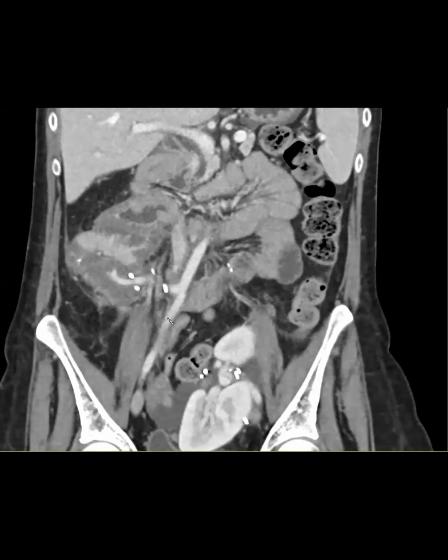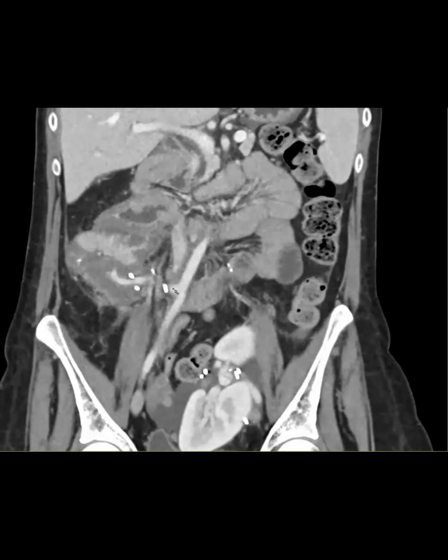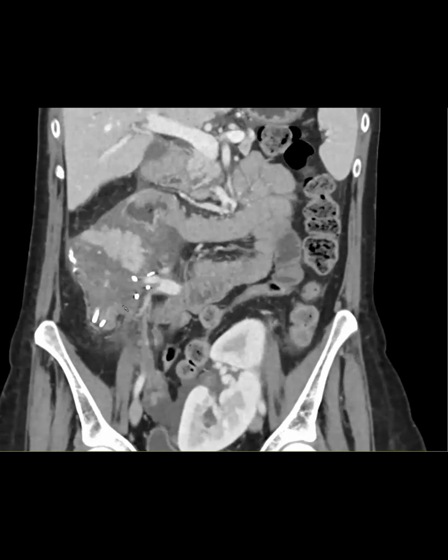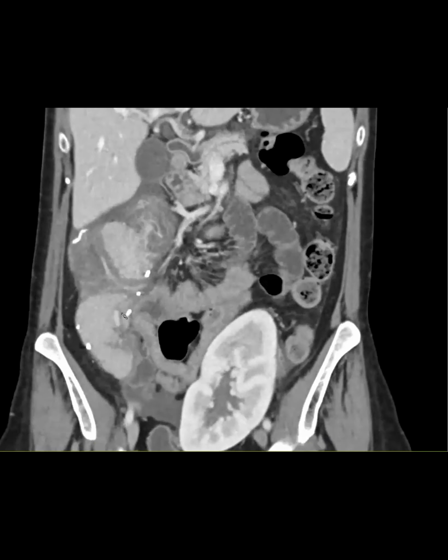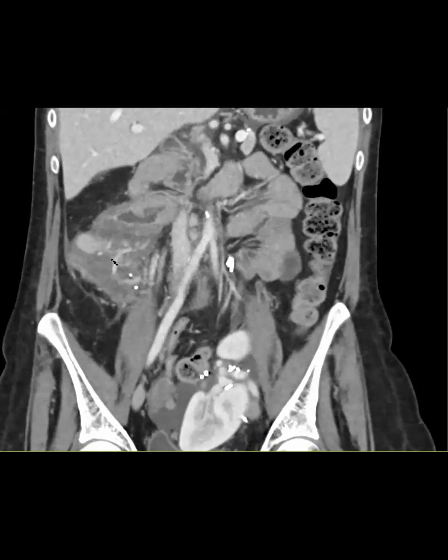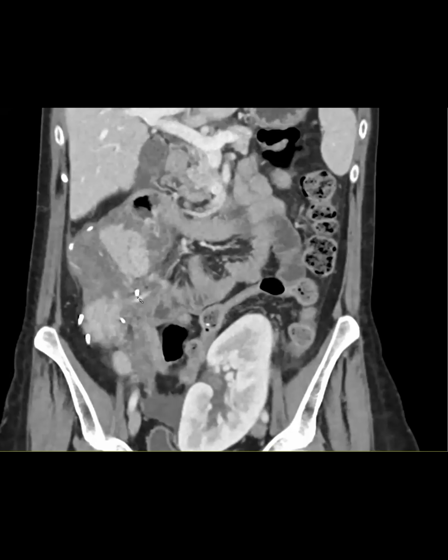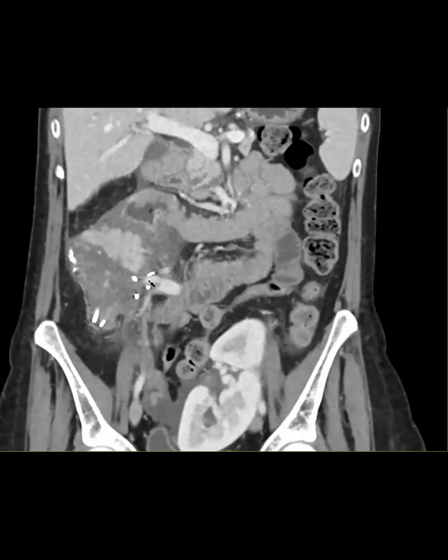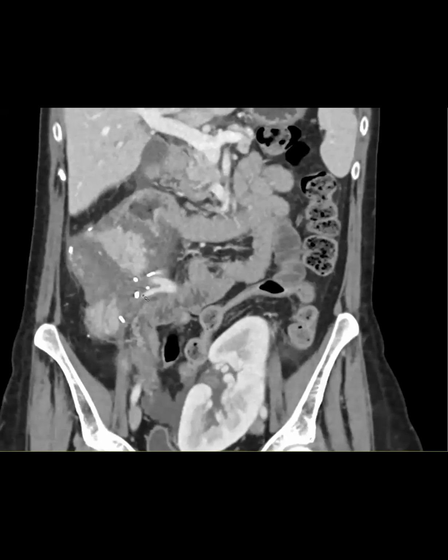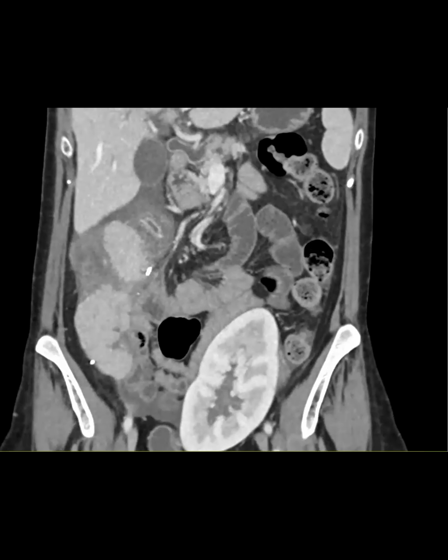So here's your external, your common iliac artery. Let's see, common iliac artery. And then this is your Y graft that is going to be attached to both the SMA, which would be probably this one, I think, as well as the hepatic artery. Oh no, wait, sorry, the splenic artery. So this will be the splenic artery going along the pancreas, and then I think this is the SMA over here, or maybe the reverse.